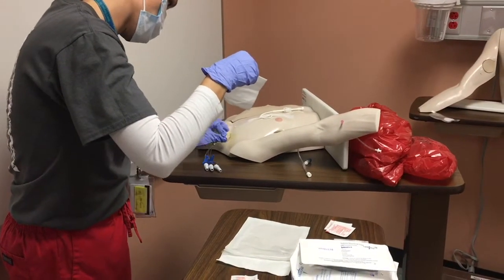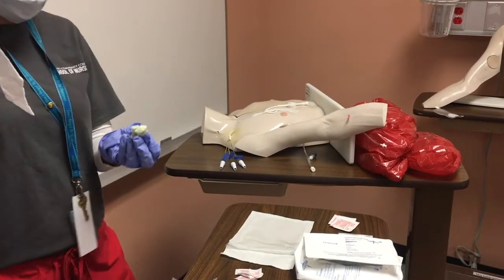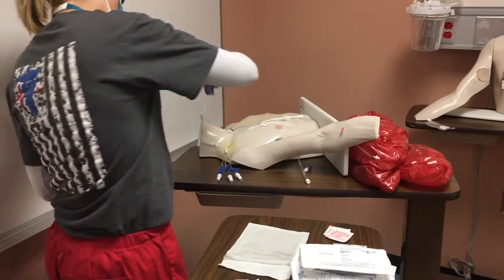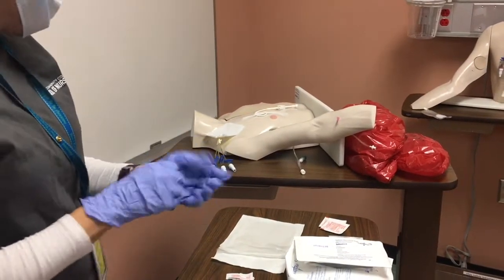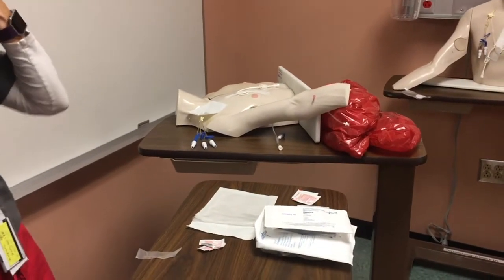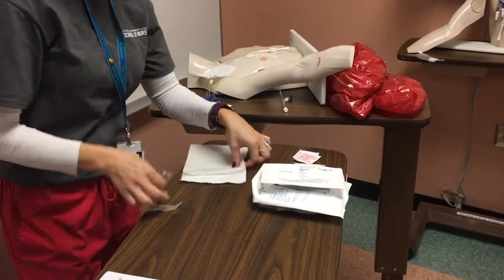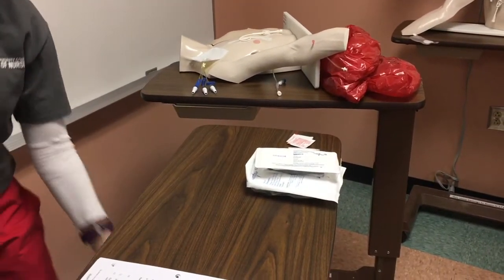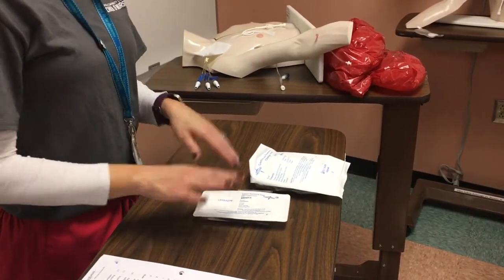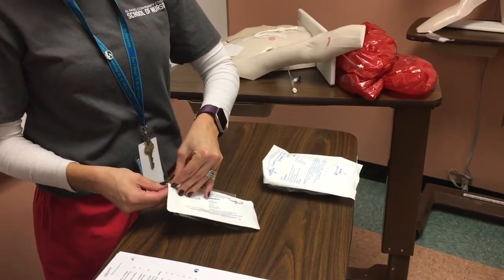That will stay like that. I'm looking — is there any green, red, or any kind of drainage? Then I place it over. Now I'm ready to go ahead and open my sterile kit. I'm going to wash my hands again because I'm getting ready to do a sterile procedure, so I want to make sure I'm all set up. I need to open my suture removal kit — I can leave the stuff inside because I can touch inside, I just need to make sure it's open.